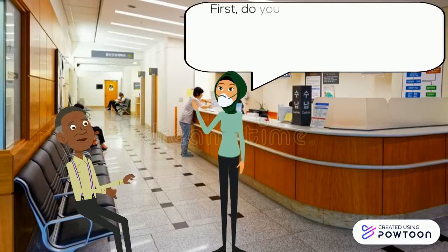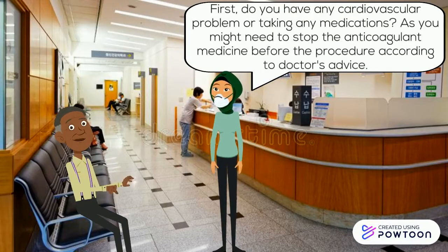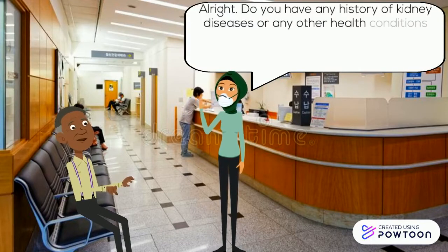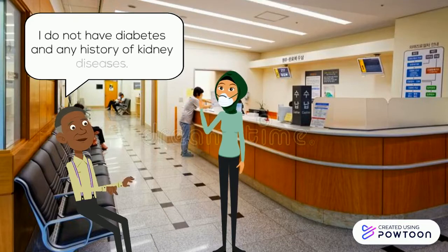Sure. First, do you have any cardiovascular problem or are you taking any medications? As you might need to stop the anticoagulant medicine before the procedure according to the physician's advice. Yes, the doctor asked me to stop taking the medicine one day before the procedure. Alright. Do you have any history of kidney diseases or any other health conditions such as diabetes? If you have diabetes, you are required to stop taking metformin 2 days before and after the procedure. I do not have diabetes or any history of kidney diseases.